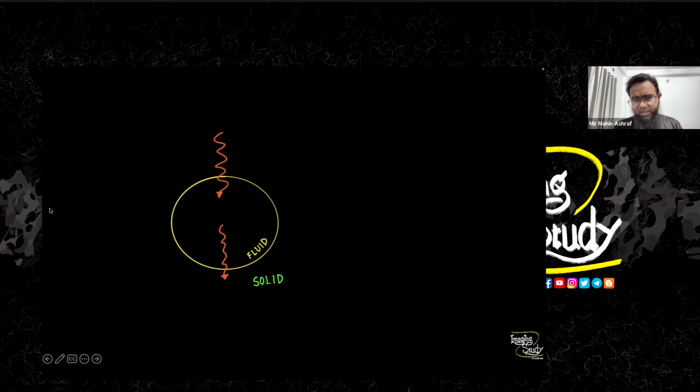Getting fluid, they are just running away. But when there is a solid part coming behind that, they get reflected too much from that part. So this is happening due to the fluid filled structure, which is giving them a platform to run faster, but getting reflected after this fluid filled area ends. So the later part will show very high reflection of sound.